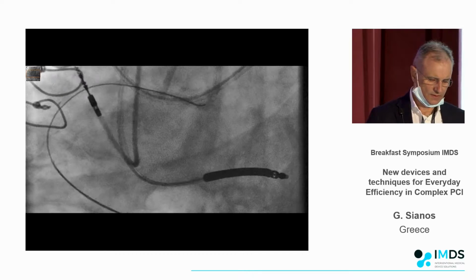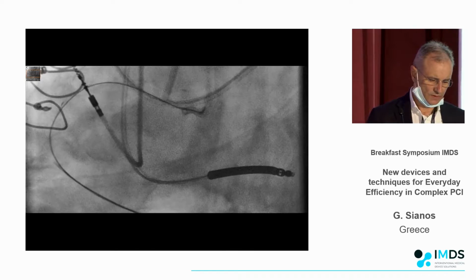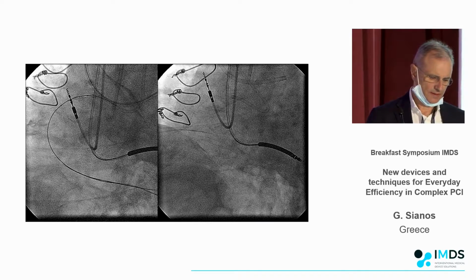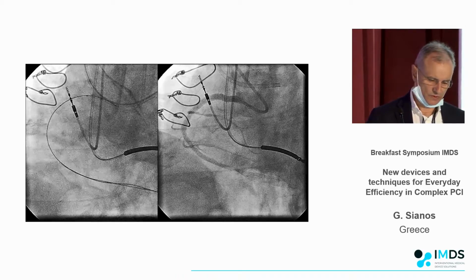And again, you can see the Blimp. We go up to this point. You see, we keep the wire aligned. Unfortunately, this one is not playing even now. But anyway, you can see that by keeping the alignment, exactly at this point is the tip of the marker of the balloon, and essentially we again followed the same principle, and the device crossed the lesion and pre-dilated.